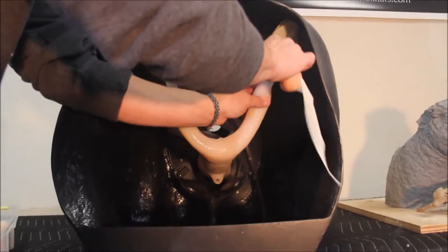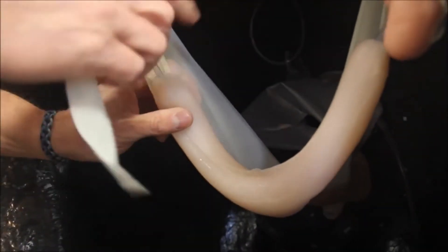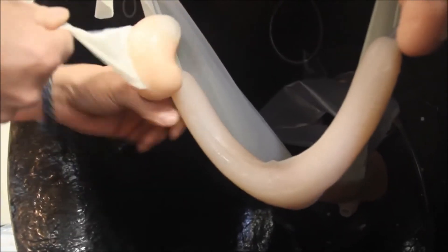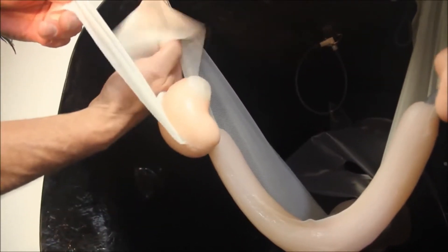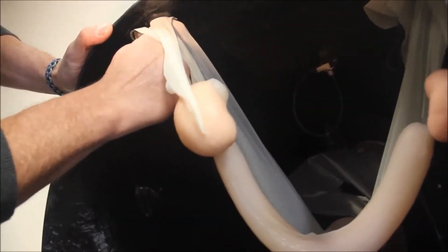The tubes on each ovary simply insert into the end of the uterine horn until there is approximately one inch or 2.5 cm of tube showing. The attached ligament is then tucked behind the magnet.